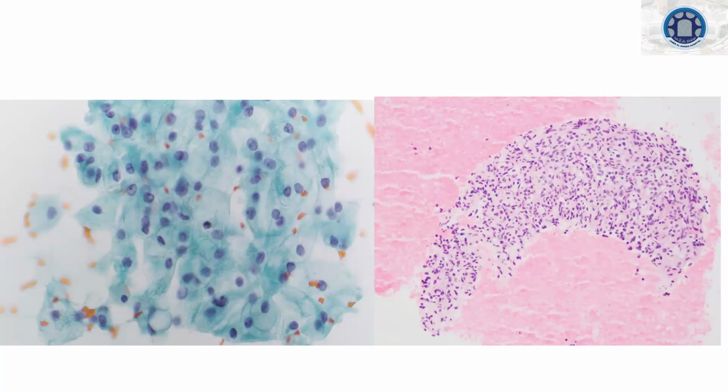Okay, now not even one person can make a diagnosis. Any of the staff can also make the diagnosis. There is a common metastasis from squamous cell carcinoma. Yes, very good. It is metastasis, but not squamous. Squamous will have dense keratin, right? You're not seeing keratinized type of cytoplasm, but I'm happy that somebody thought about metastasis.